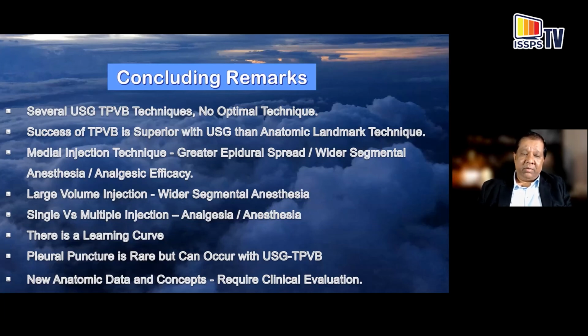Yes, it is technically more challenging than doing an ESP block, if you may, but it produces a very high quality somatosensory block, the afferent nociceptive block that can actually abolish your somatosensory evoked potential. If you look up the data in the literature, there are no other blocks that have been documented that can abolish the afferent somatosensory evoked potential.